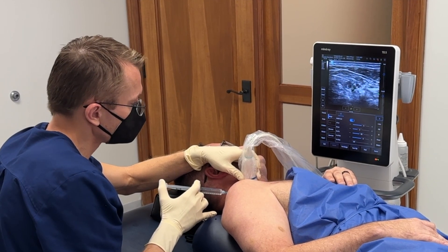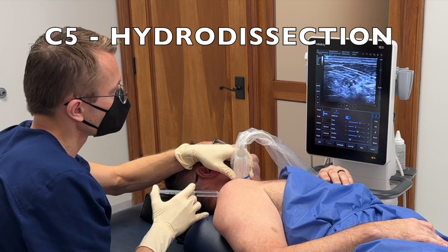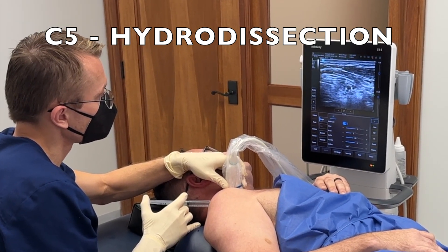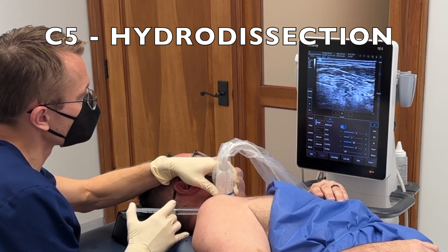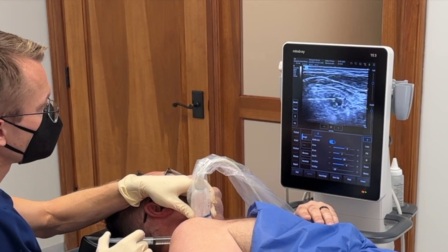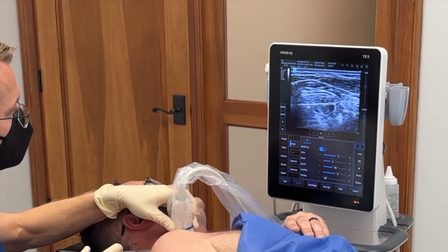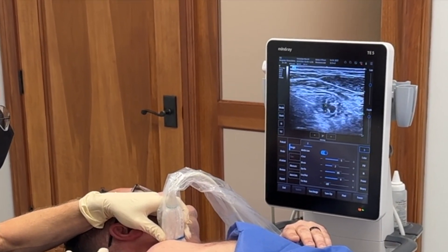So the nerve is in the middle of the screen and you're going to see my needle coming in from the left. I'm going to approach the nerve. Here's my needle on the left approaching the nerve, and here's the fluid solution spreading around the nerve root. I'm going to go above it, and I'm going to go underneath it as well.